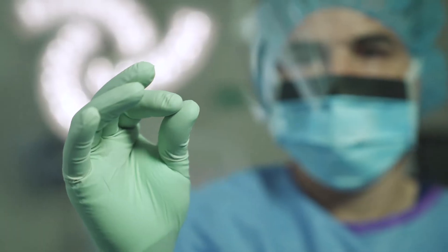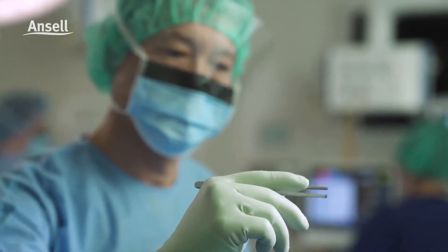A non-latex PI hybrid glove that combines the strength I need with the comfort I want. Now that works for me.